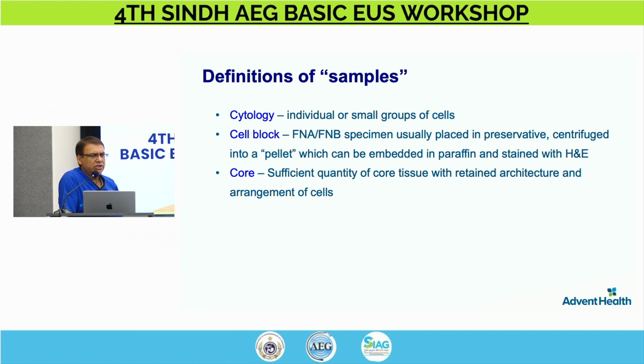If you have a good tissue, it likely is better to put it in formalin. That is a better preservative. And then it goes to the lab. They make pellets out of it, and then they cut it into very fine cuts after it is embedded into paraffin, and then do an H&E staining.